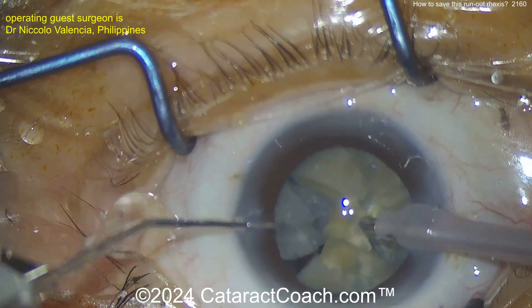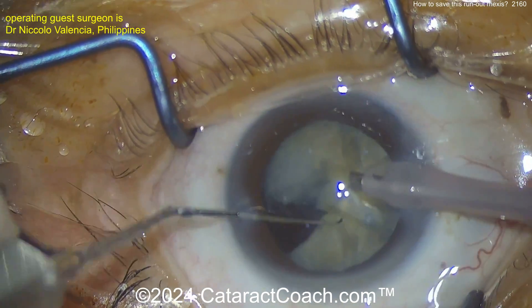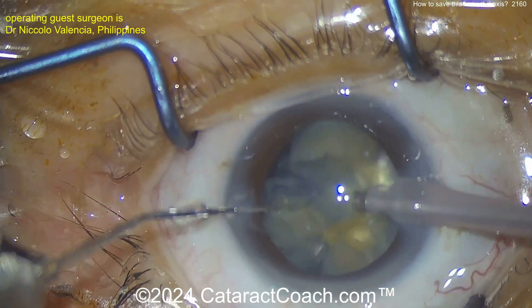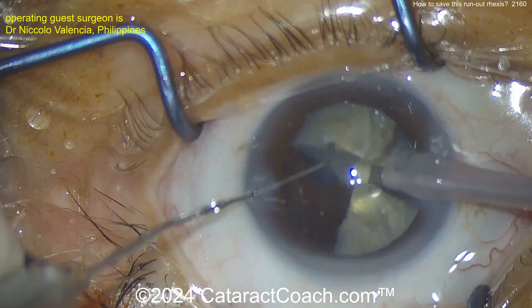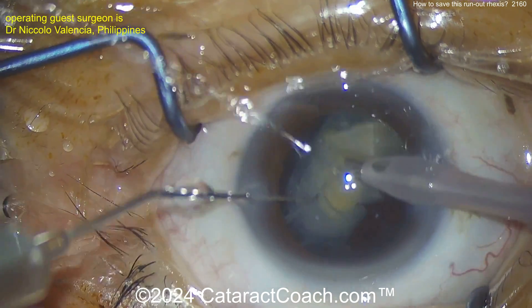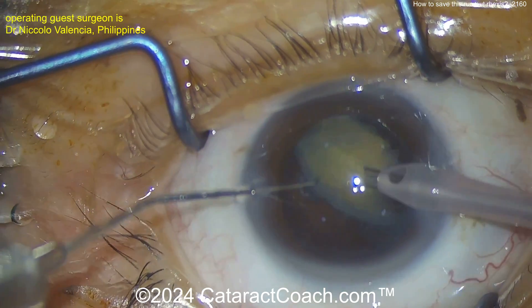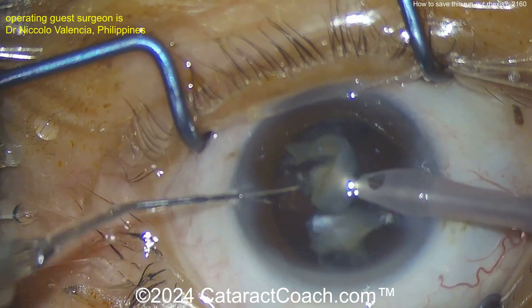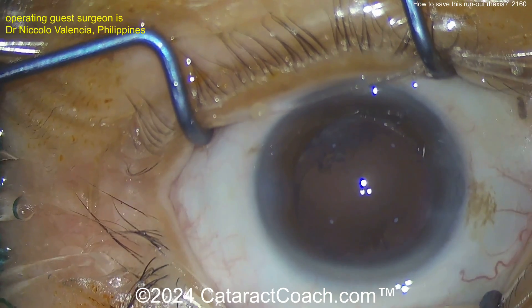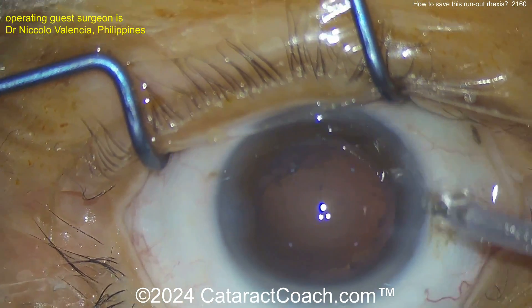Taking these pieces out nice and easy — beautiful technique, nice and gentle, not putting any pressure on the capsular bag. We have to show these challenging cases so that when this happens to you, you know what to do. That last piece comes up nicely done. Be cautious when cleaning up that bag — don't pull on the capsule in the area where it has radialized. We've got those two radialized areas.